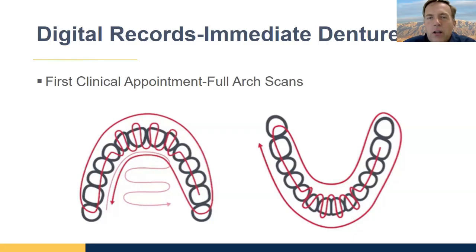I had a question here. How long should you wait to scan patients with immediate denture since the tissue may be swollen post-surgery? Agreed. I would say you're probably going to want to wait at least, I've heard 6 weeks to 4 months, depending on the person and depending on how stable you want the case to be.